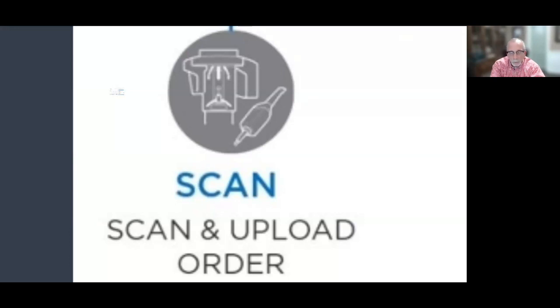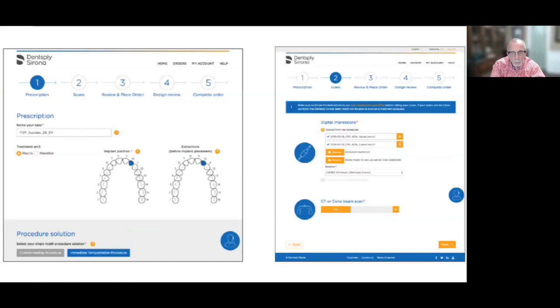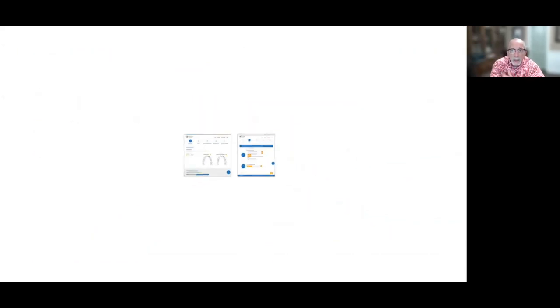Now, in the implant workflows, that's typically 2 scans, right? A CBCT scan and an intraoral wand scan. So you're going to take those 2 scans and go to some portal, some website, and upload those 2 scans, and you're going to indicate, and with the Azento, it's like 2 pages of very, very simple answers. What tooth? What am I trying to do? Kind of thing. Upload the files, right?